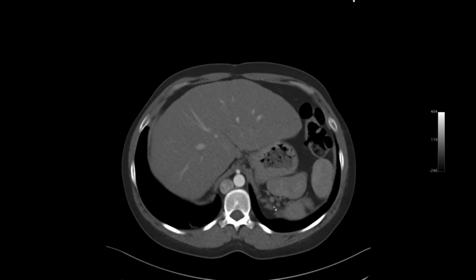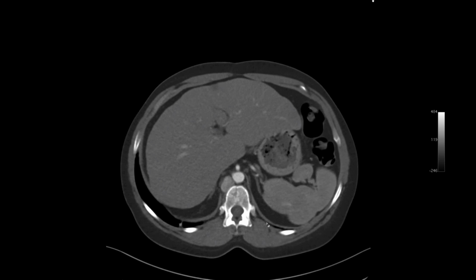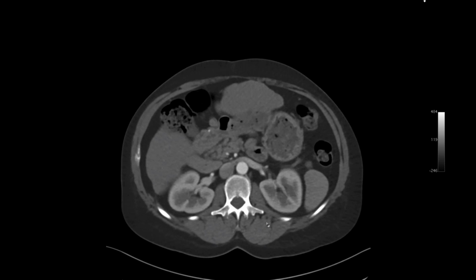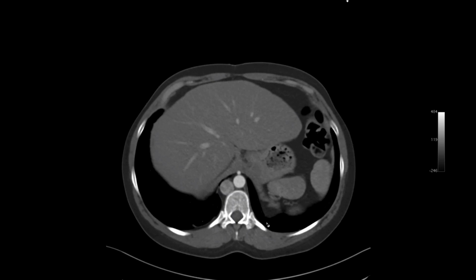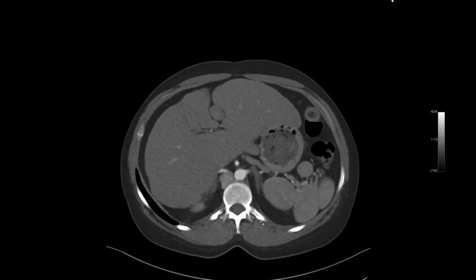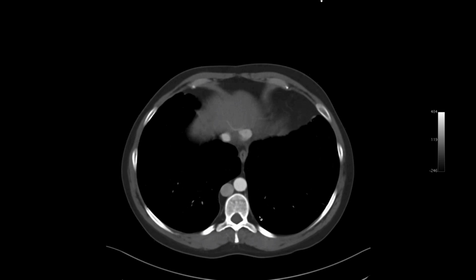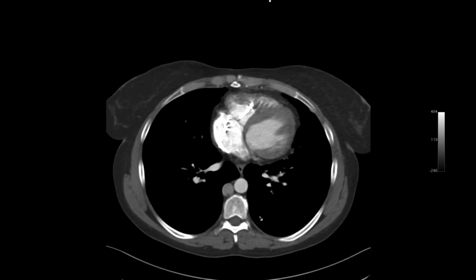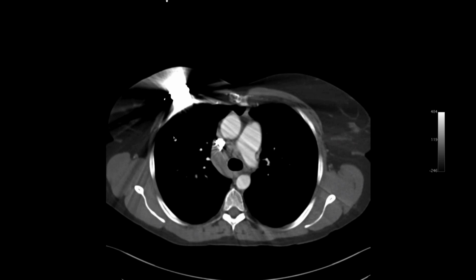Yeah, or it's like it was thinking about it, but didn't go through with it. Yeah, didn't quite make it. And yeah, if I remember, I think it's one of those. I was going to say that a lot of times these situs abnormalities just don't fit entirely within the polysplenia or asplenia forms or frameworks. Yeah. So just a bunch of interesting things that came together.